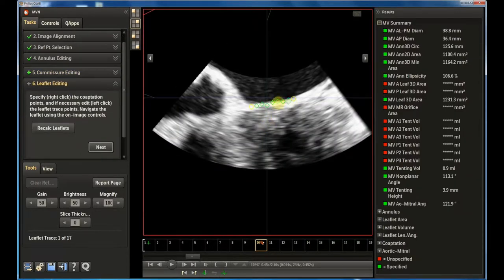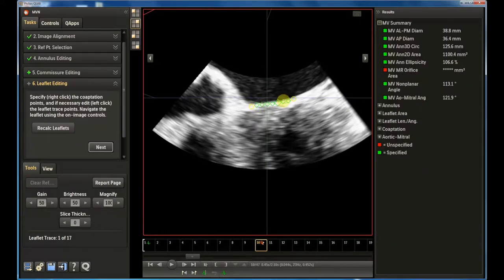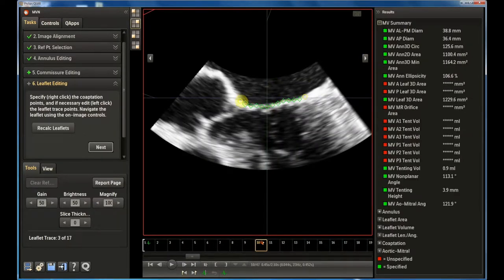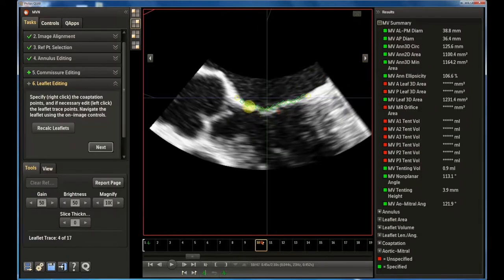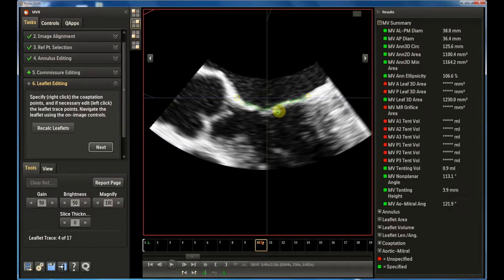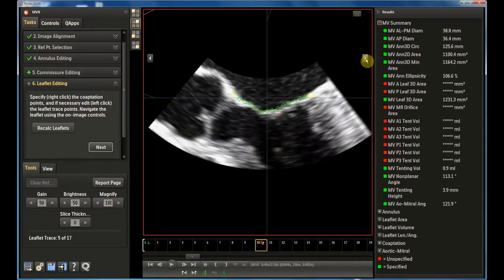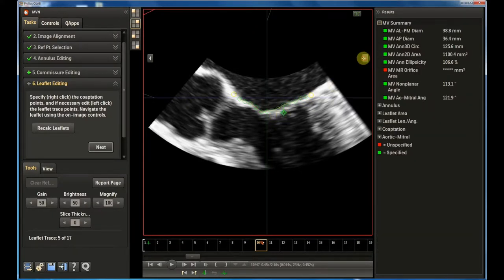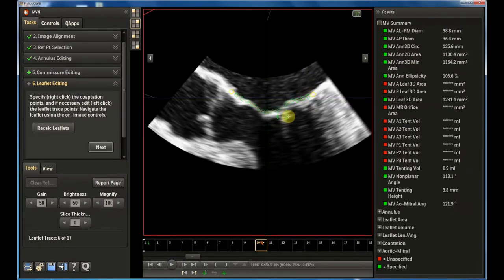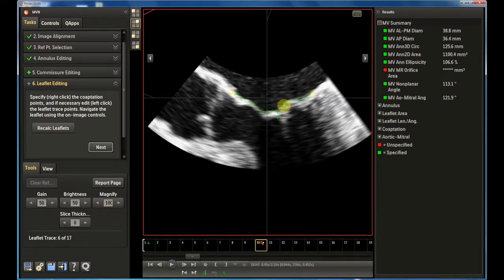The leaflet editing consists in the adjustment of the automatically generated atrial surfaces of the leaflets. Holding the left click of the mouse and sliding over the leaflet profile, the green marks will move accordingly. This small red square is the coaptation point and if present should be adjusted before the surface. If the leaflets don't coapt, the surface can be split. Unfortunately, it is impossible to overlap the two leaflet surfaces.